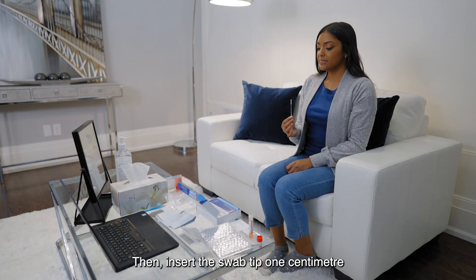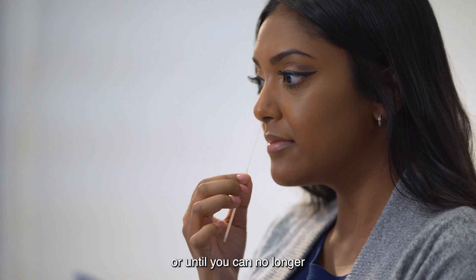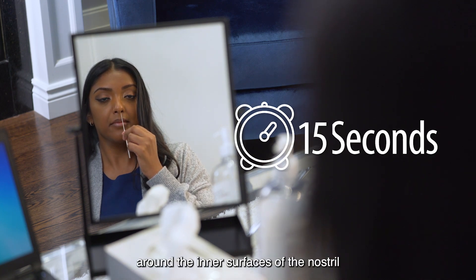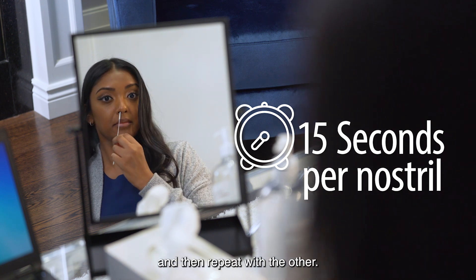Then insert the swab tip one centimeter or half an inch into your nostril, or until you can no longer see the bristles. Using a mirror can help. Rotate the swab firmly around the inner surfaces of the nostril for 15 seconds in one nostril, and then repeat with the other.